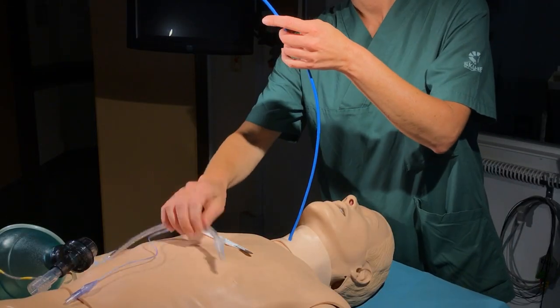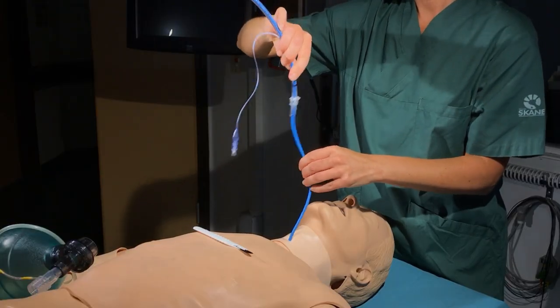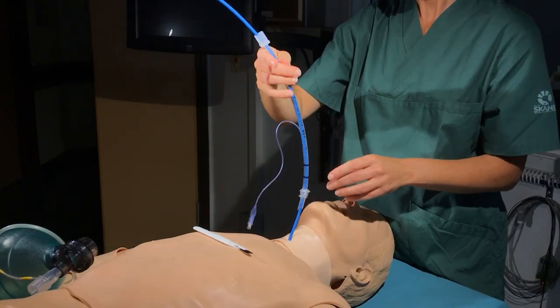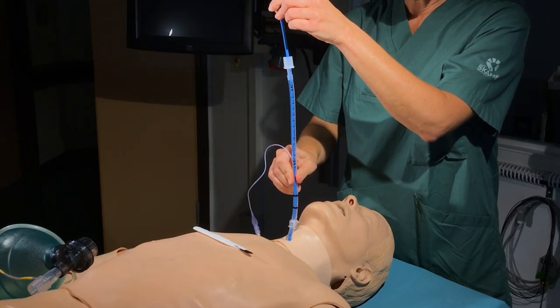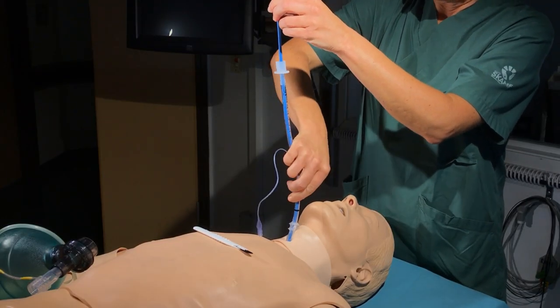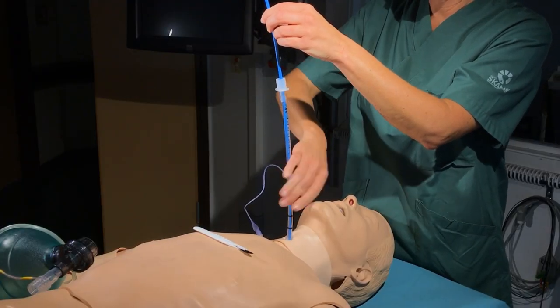The endotracheal tube is railroaded on the bougie into the trachea. It can be a bit tricky to pass the soft tissues, particularly on this mannequin, so a slight rotating motion might be required to get into position in the trachea.